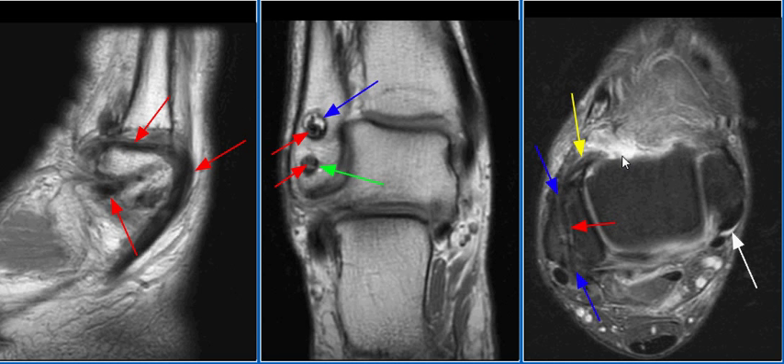anterolateral talus, reconstructing the anterior talofibular ligament, as seen on this image with the yellow arrow. The tendon then courses posteriorly through a tunnel in the lateral malleolus, approximately one centimeter above the tip of the lateral malleolus, as seen on this image with the red arrow.